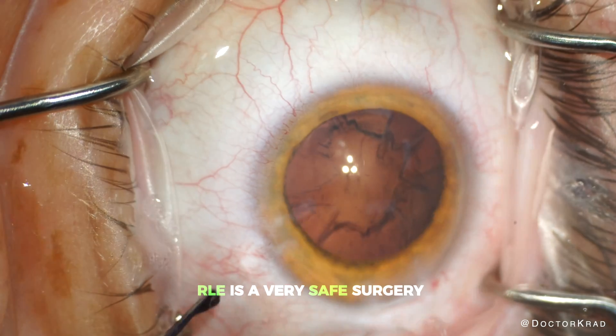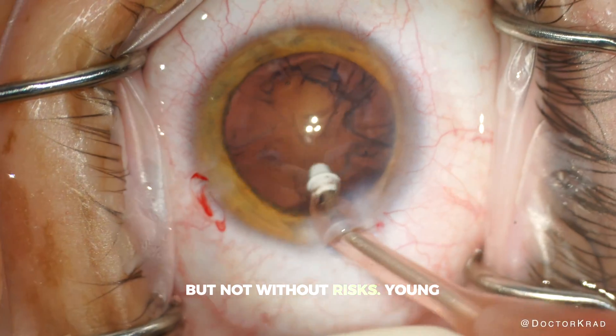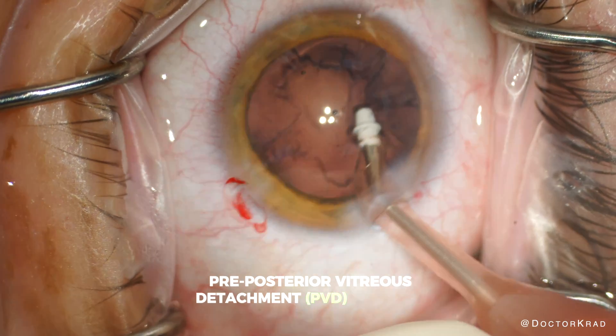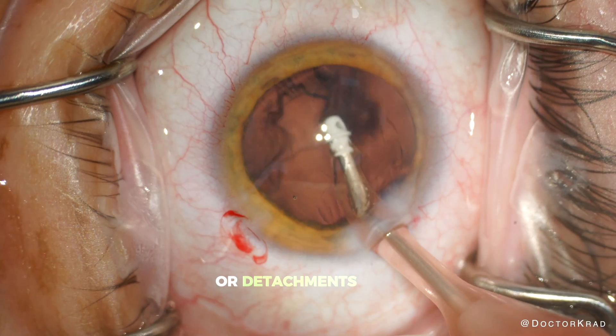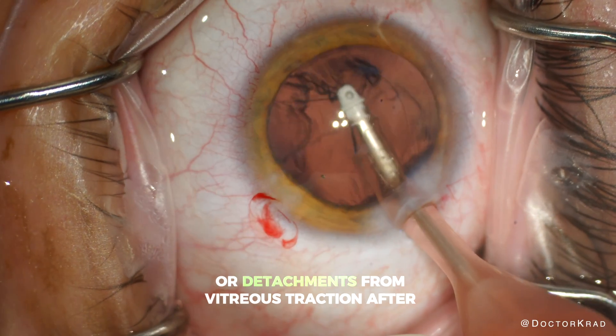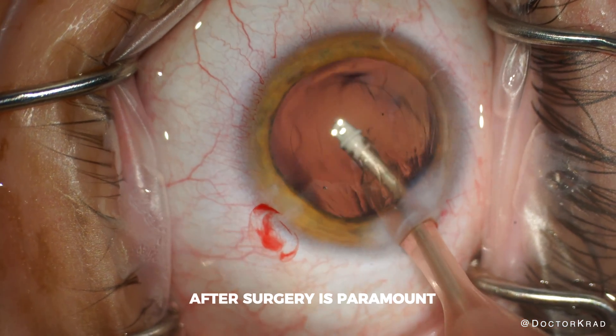RLE is a very safe surgery with good technique, but not without risks. Young pre-posterior vitreous detachment patients especially are at higher risk for retinal tears or detachments from vitreous traction after surgery. So thorough examination of the retina after surgery is paramount.